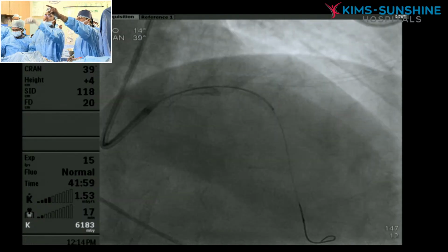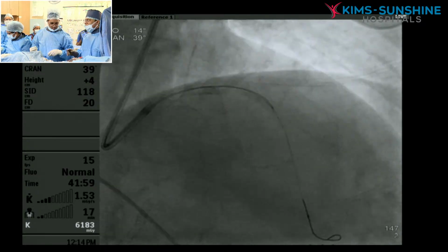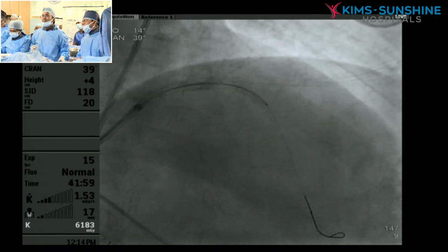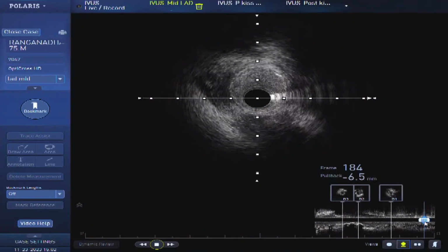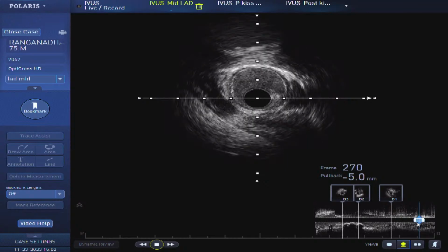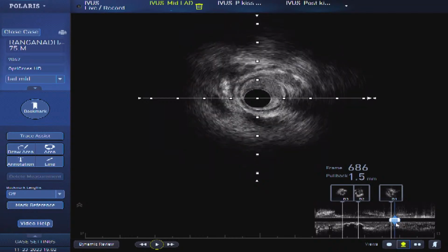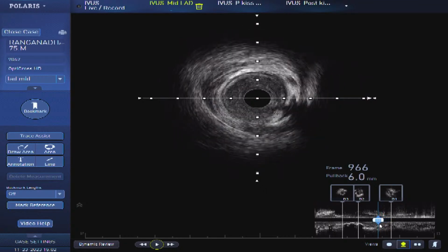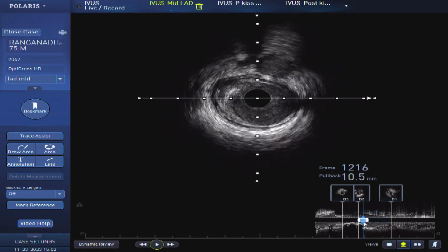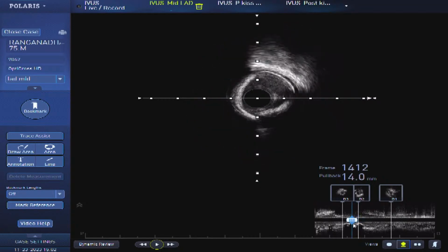కింద మనము అంటే 2 ఉన్నాయి కదా, 2 బంప్స్ మధ్యలో వేద్దాం. దట్స్ ఫైన్. కొంచెం మూవ్ చేయ బ్రదర్. మెల్లగా మూవ్ చేయండి. సి, అంతా మైకార్డియల్ బ్రిడ్జ్ అండి. అది మైకార్డియల్ బ్రిడ్జ్. కమ్. అక్కడ కొంచెం ప్లాక్ ఉంది కానీ వెనక్కి ఒక స్పేస్. ఇది బాగానే ఉంది, నార్మలే. కమ్. ఇదంతా నార్మలే. ఇంకా రండి. బంప్ టు బంప్ వేసేద్దాం చాలు. ఫోకల్. దట్ ఈస్ ద టైటెస్ట్. ఓన్లీ ప్రాక్సిమల్ చేసేద్దాం అంతే. అది బ్రిడ్జ్ అది.